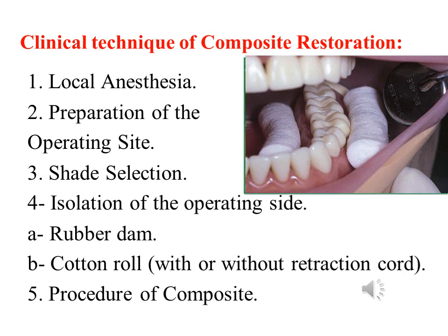Shade selection. Of course, a shade selection by the shade guide. 4. Isolation of the operating site. We must have complete isolation for the operating site from the saliva, from blood, from any fluid surrounding the tooth which had been prepared.